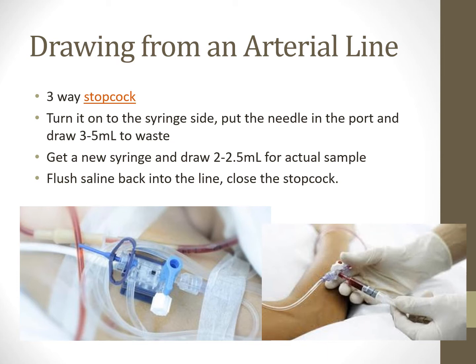But once you get your blood gas sample, you're going to flush the saline or flush whatever's in the bag back through the line. So there's this little tab, and you'll see it over here on the transducer. You just sort of pull that tab, and it allows the solution from the pressure bag to be flushed through there. So any blood that's in the line, therefore, goes back into the patient. So you always want to make sure the blood goes back in: clean to site.